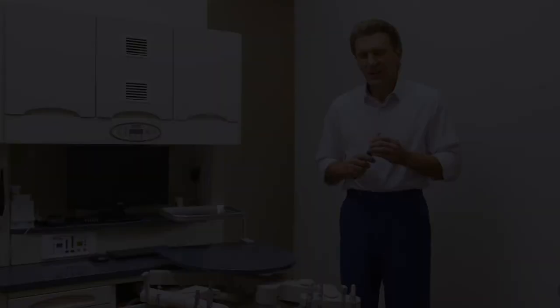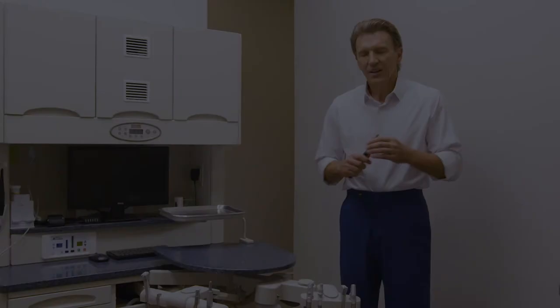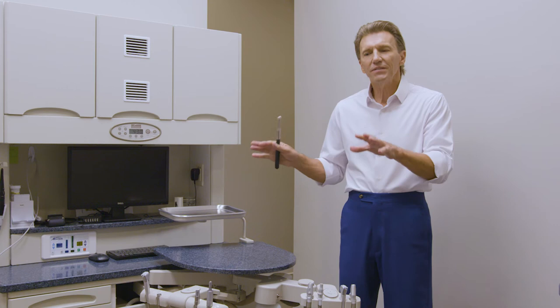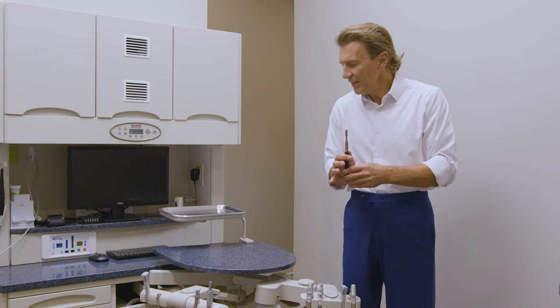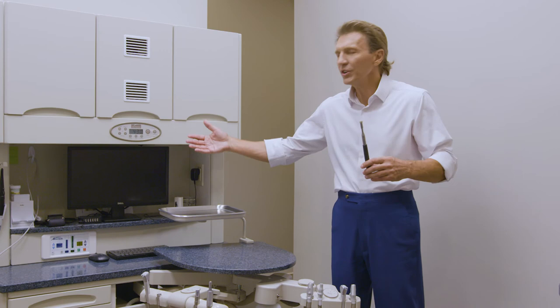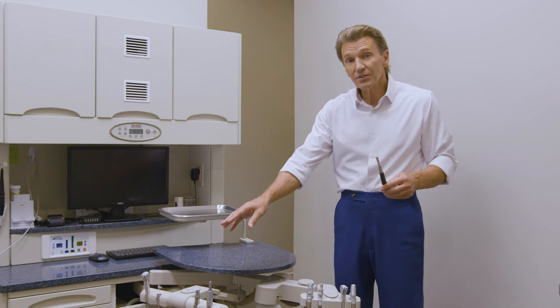We now have a different delivery unit configuration to consider. In the previous operatory, we had a split delivery configuration where the doctor's module was attached to the base of the chair and the assistance module was attached to a flexible 12 o'clock work surface, which was in turn attached to a 12 o'clock cabinet. In this delivery unit option, the doctor's module is now attached to the same flexible 12 o'clock work surface as the assistance module. There are a couple of big advantages to doing this.